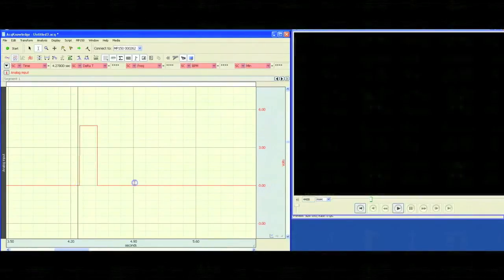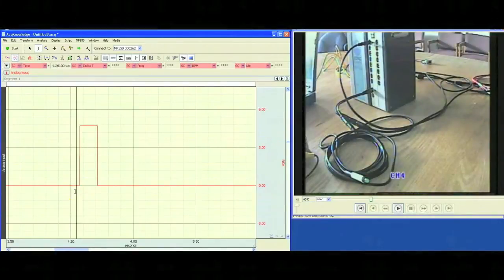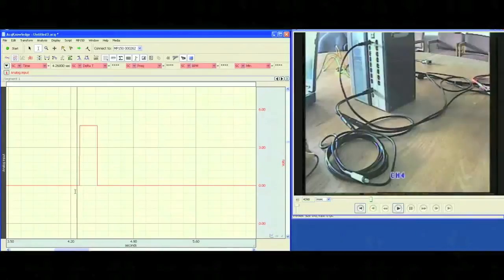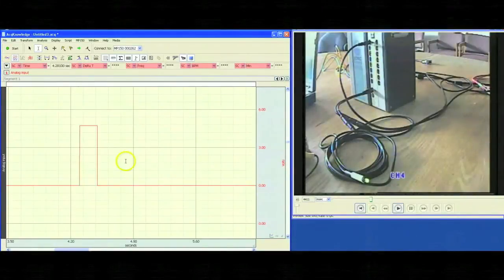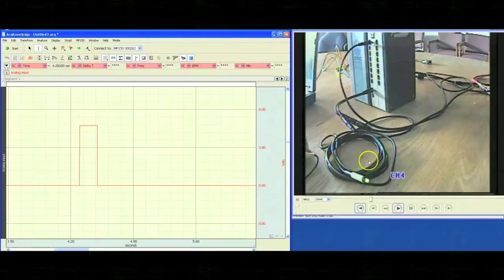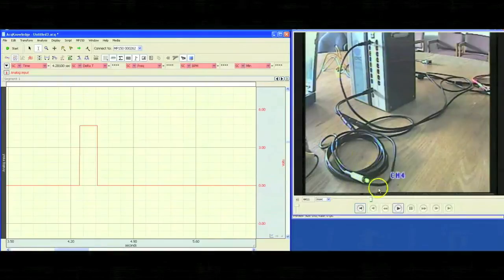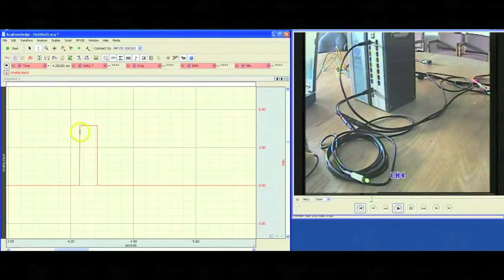Right here, you can see the light is not on. If I move a little bit forward, we're going to keep going until the light flashes. Okay, so here, we can see the camera is capturing the flash, but over here, it's not showing our peak.